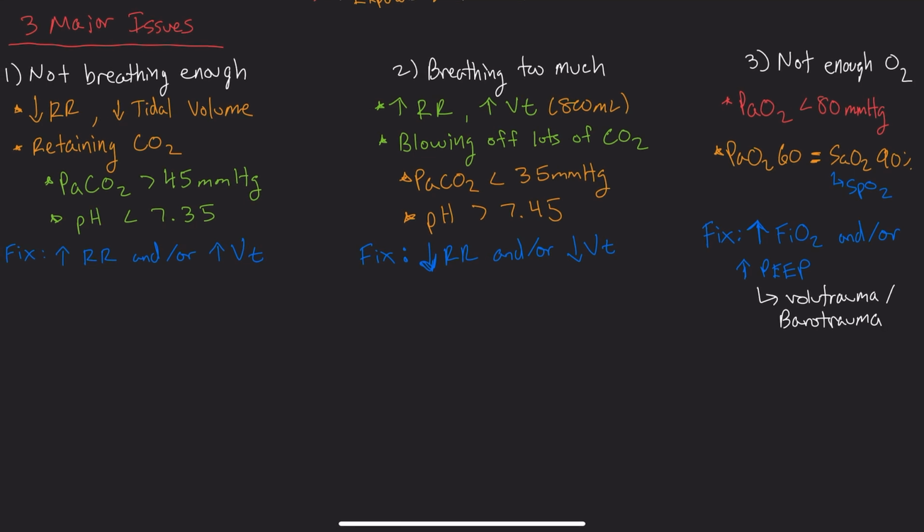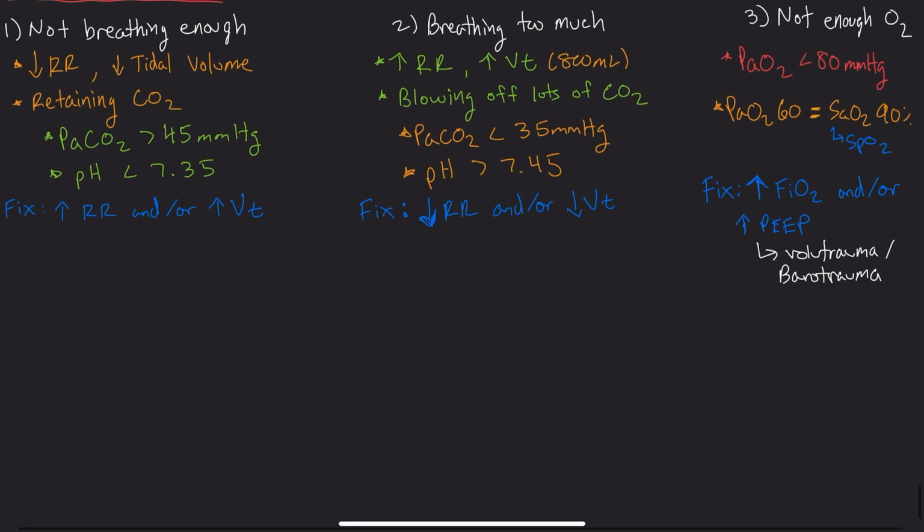Okay, so those are the 3 major issues there that we can correct. I just want to do a quick recap here, and then we'll do some examples. Okay, so a quick recap. If you're trying to correct the pH based off of the PaCO2, then there's 2 things you can do.